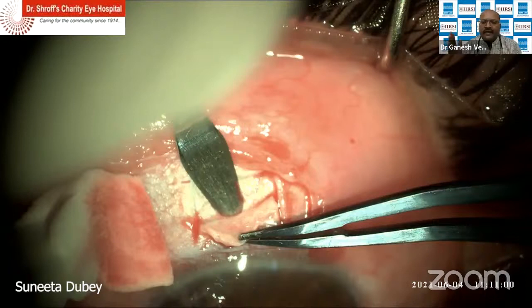It's very simple. And we don't use a crescent because the crescent comes in an angulated form. So use a Baden-Parker number 15 blade. We've been doing this and teaching it, and I think it's a very simple trick to achieve the correct depth. We lift the flap with the number 15 blade itself, so the view is pretty good and you don't have a crescent obstructing the view. What is the size of the base of the triangle at the cornea level? If it's a trab, it's 5x5. If it's a phaco trab, it will be 4x4. 4 to 5, depending upon what one needs.